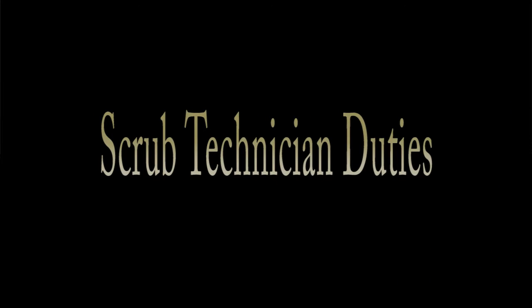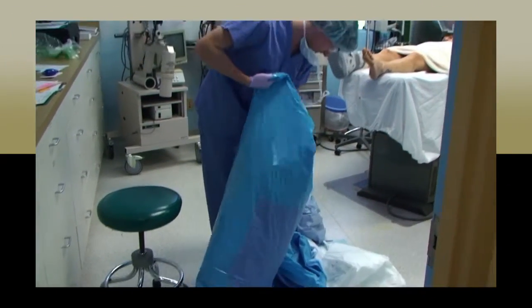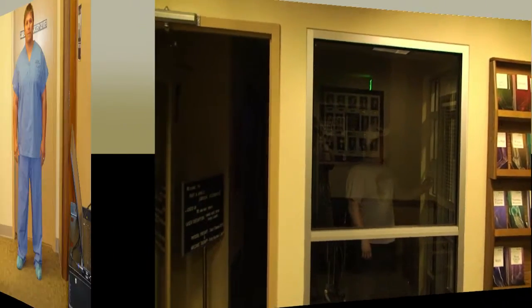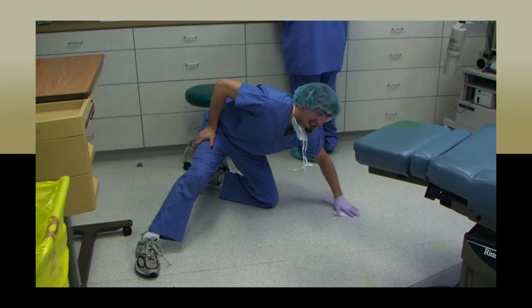As the surgical scrub technician, or scrub, your duties will be to oversee the overall cleanliness and preparation of the operating room. After you have arrived, open the office, and don the proper surgical attire, you will be in charge of opening and preparing the OR for the surgical case. Your first duty will be to mop the floors and wipe down all hard surfaces and equipment with CaviWipes. Be sure to use universal precautions when doing this, such as gloves, mask, gown, and eye protection.